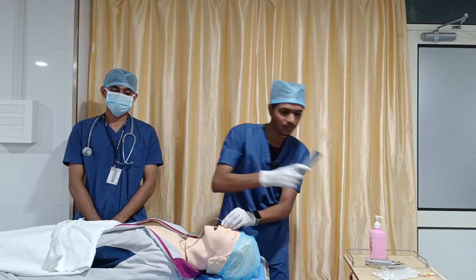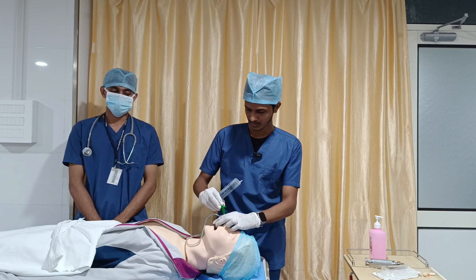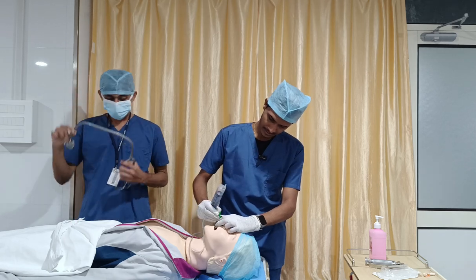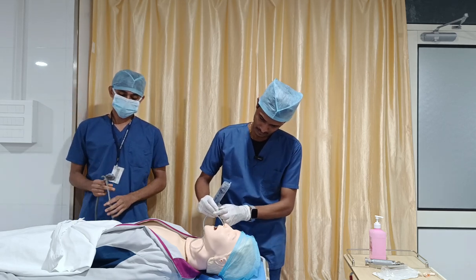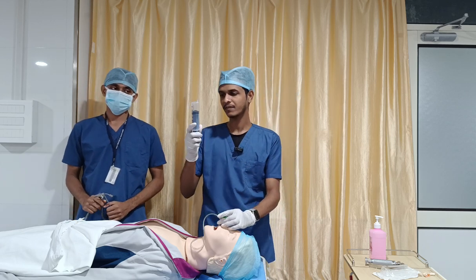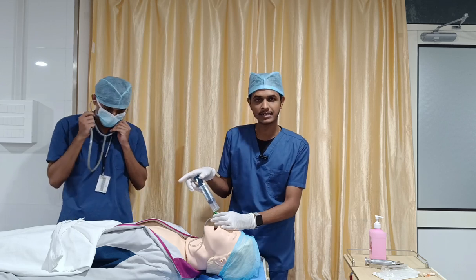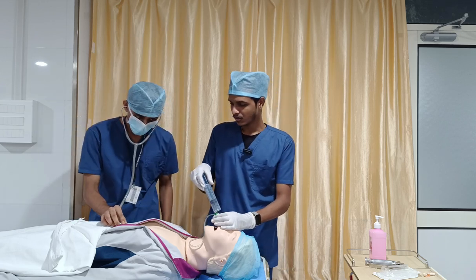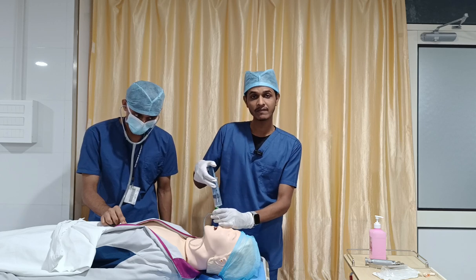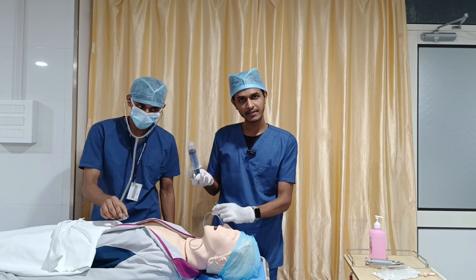Here I am going to verify my catheter. So I have my aide. Take a 50 cc syringe, then take around 10 to 20 ml of air, and then ask your aide to auscultate over the epigastric region. Okay, so he placed the stethoscope over the epigastric region, and then I have to give a thrust of air. Okay, so again I have to re-verify that.